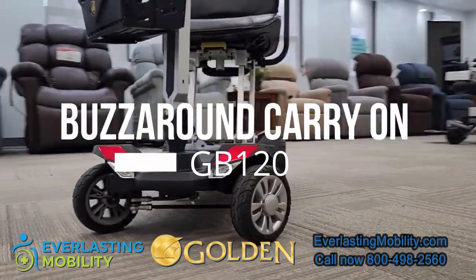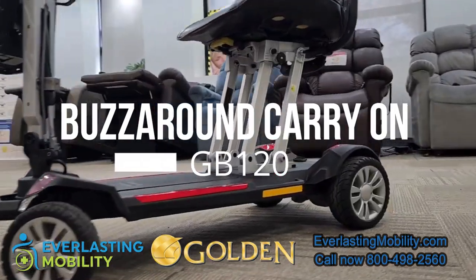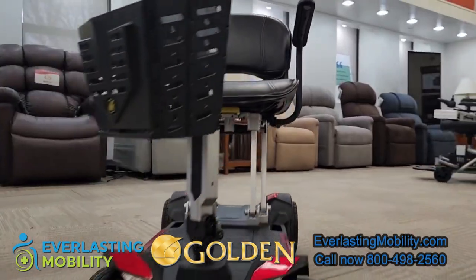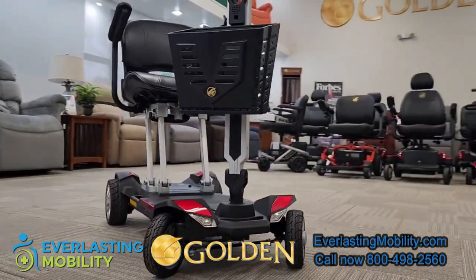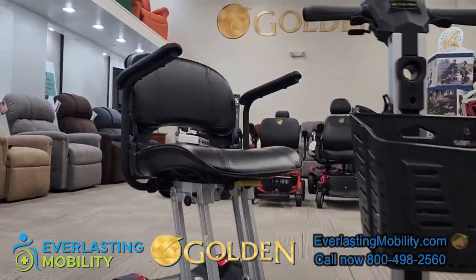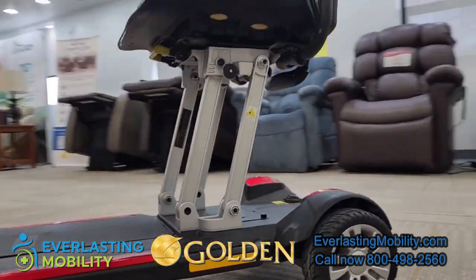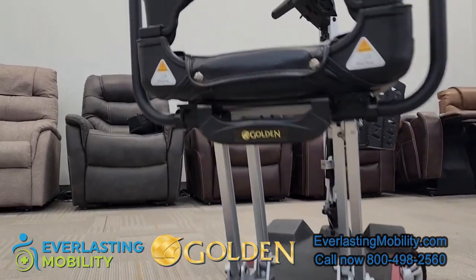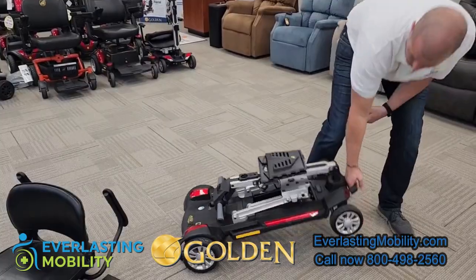This is one of the top selling folding mobility scooters in the industry right now. It does have a 300 pound weight capacity. You can get a standard battery or an airline approved battery. The total weight of this scooter when fully assembled is around 65 pounds. However, if you remove the seat and the battery, the weight drops to just under 48 pounds, so it is a really light scooter.